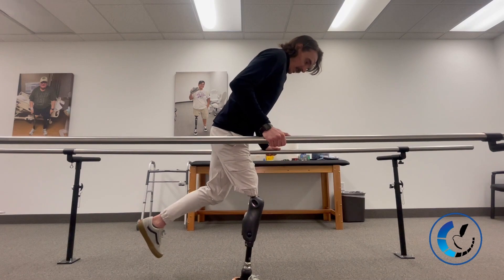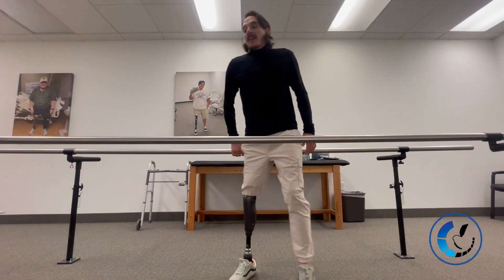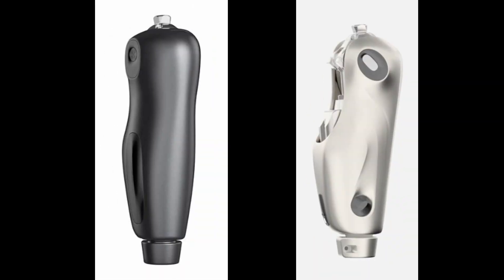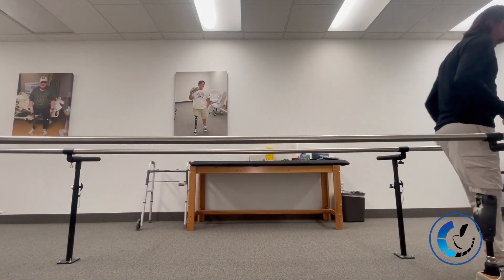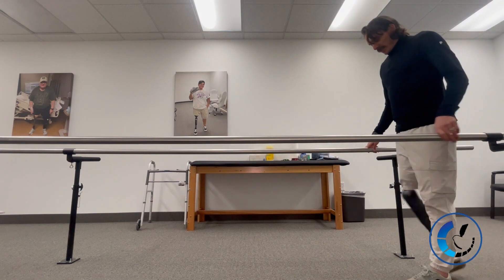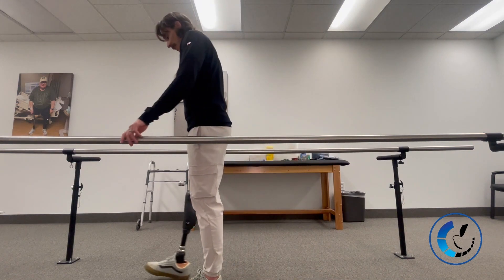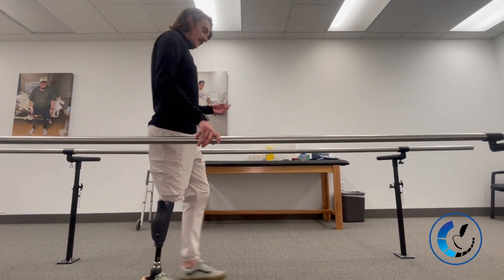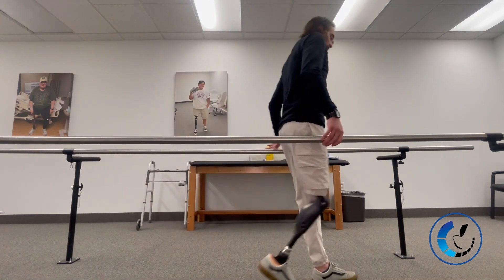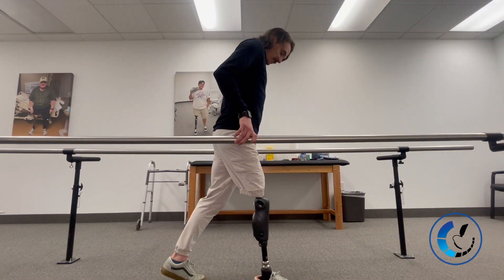This knee comes in a black version and a pearl white they call 'Stormtrooper,' so two color options. Here I'm demonstrating short steps and swing initiation. That's one thing I really like this knee for with new amputees — it releases into swing easier than a lot of knees, making it much easier for a new transfemoral patient to understand how the knee is going to function.